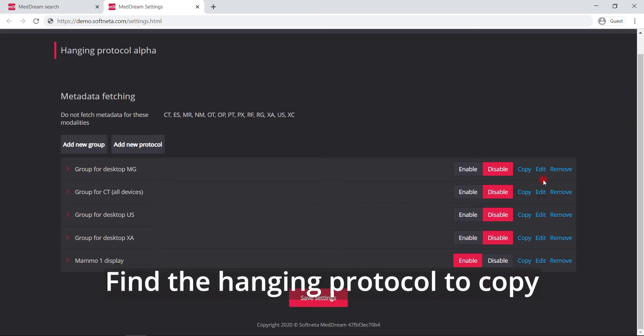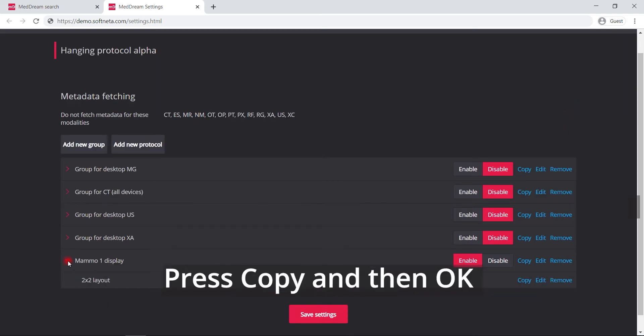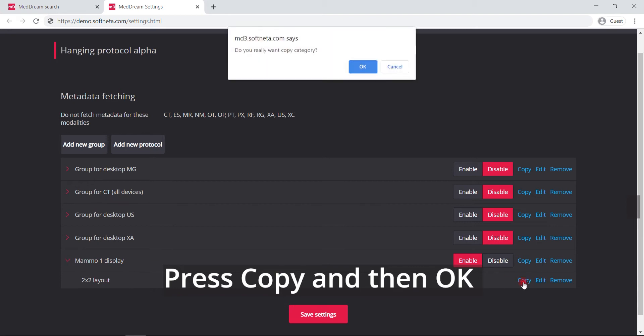Find the hanging protocol you need to copy. Press copy on that protocol and then OK.